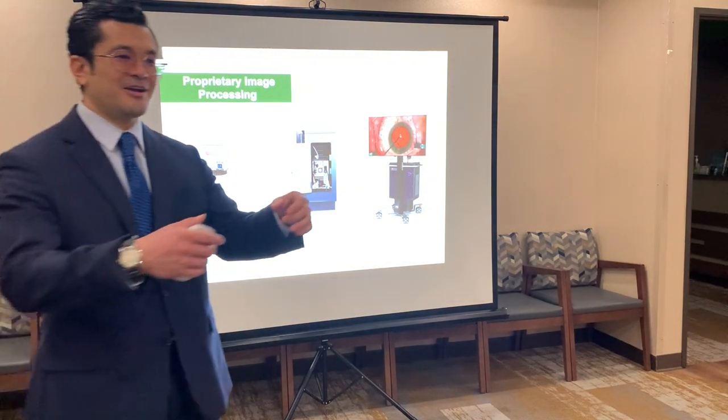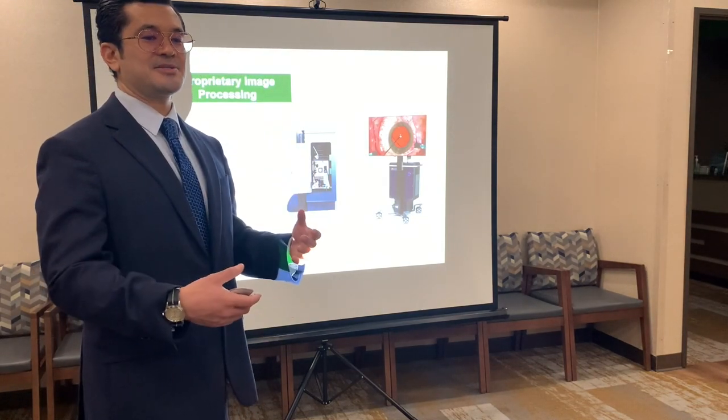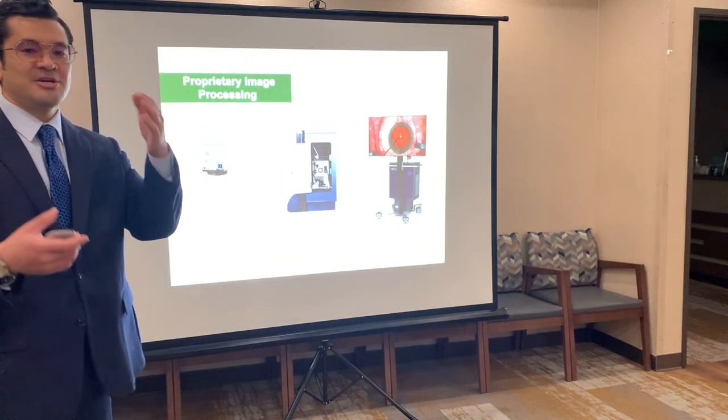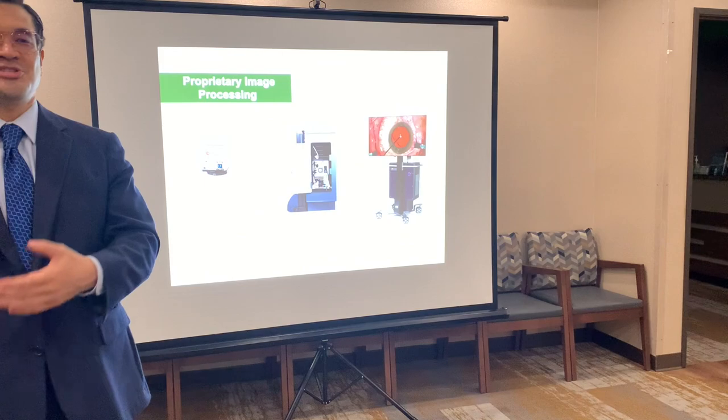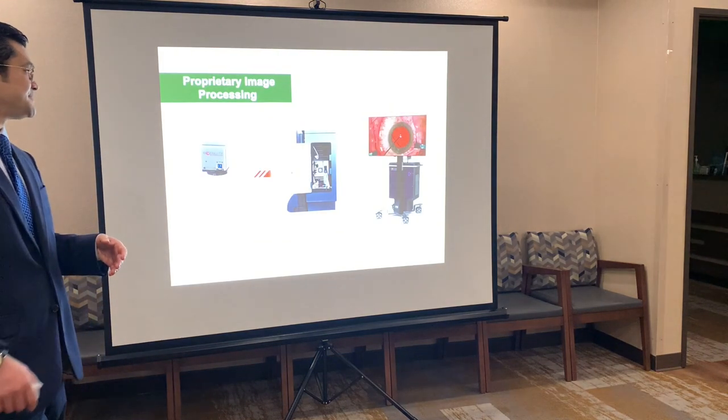So now I'm not going to be hunched over a microscope. I'm going to sit back and operate with better ergonomics, and everyone in the room can see the 3D, and then when we record these, we can showcase it to people in 3D, and you'll get more of the nuance of surgery.